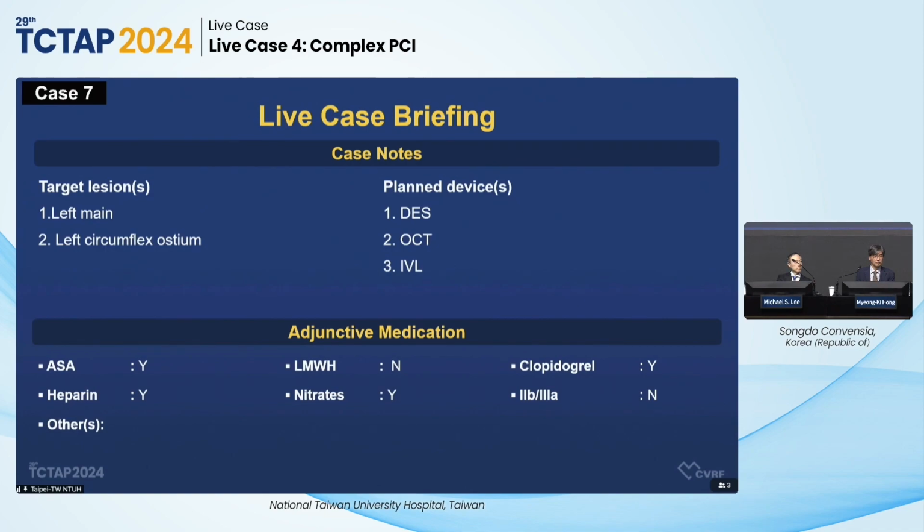Well, I think one picture says 1,000 words. Why don't I just show you our first diagnostic angiograms? It's a very complicated CAD, and the patient also had a mild aortic stenosis. Can we shift to the angiogram? Yes, we did not see it.